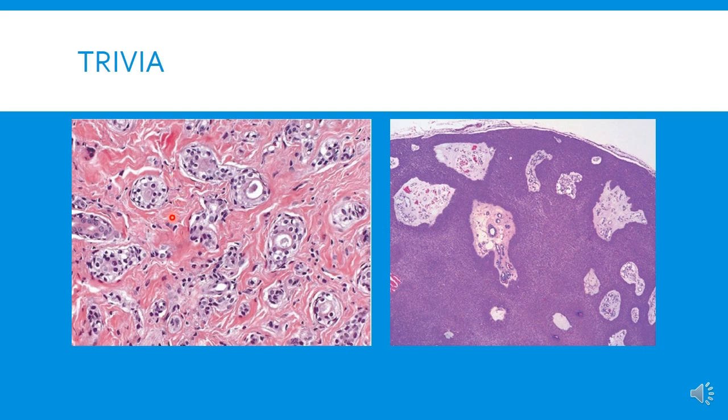There are these ductal structures in a very sclerotic or fibrotic stroma. These ductal structures are embedded in the stroma, and some of these ducts have a double layer of cuboidal cells with eosinophilic secretion in the lumen, and some of them have a comma tail like appearance also. So what could this tumor be? What is this pattern? This pattern is a ductal pattern, and if you recall, the tadpole or paisley tie pattern.